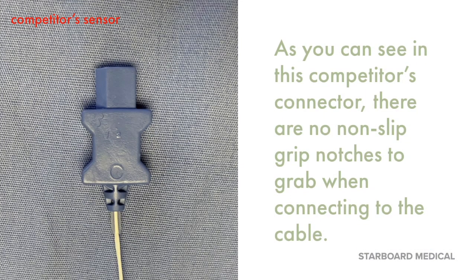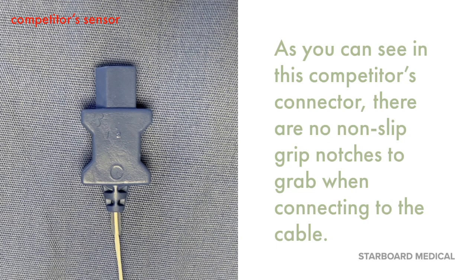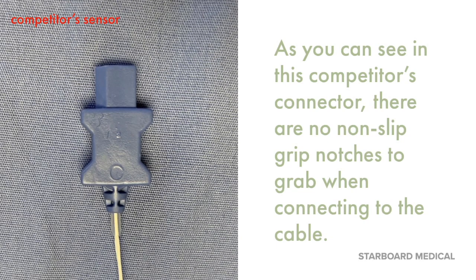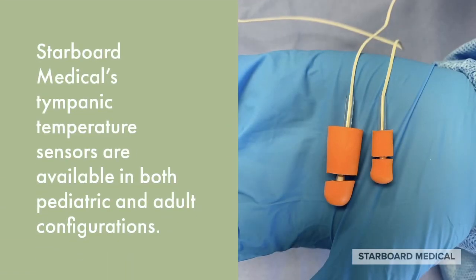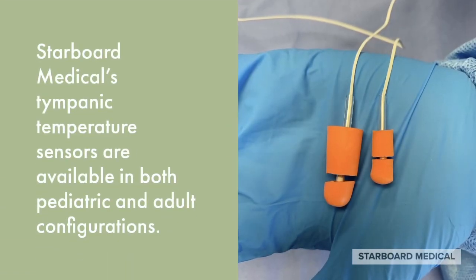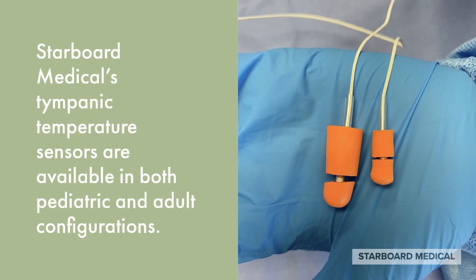As you can see in this competitor's connector, there are no non-slip grip notches to grab when connecting to the cable. Starboard Medical's Tympanic Temperature Sensors are available in both pediatric and adult configurations.